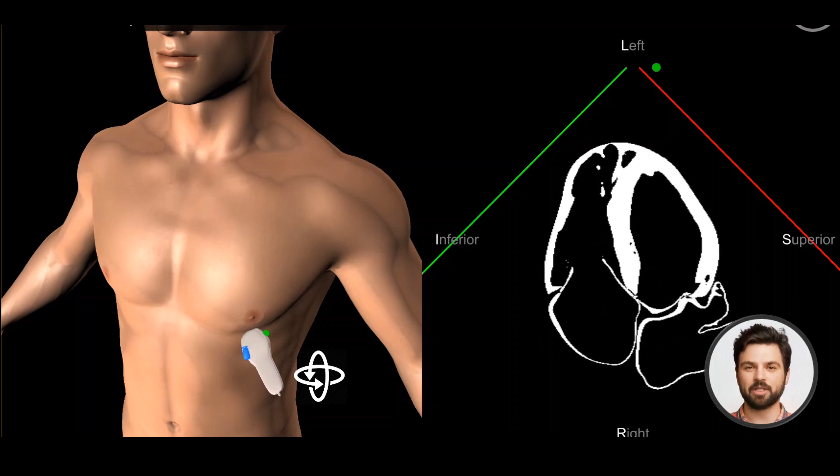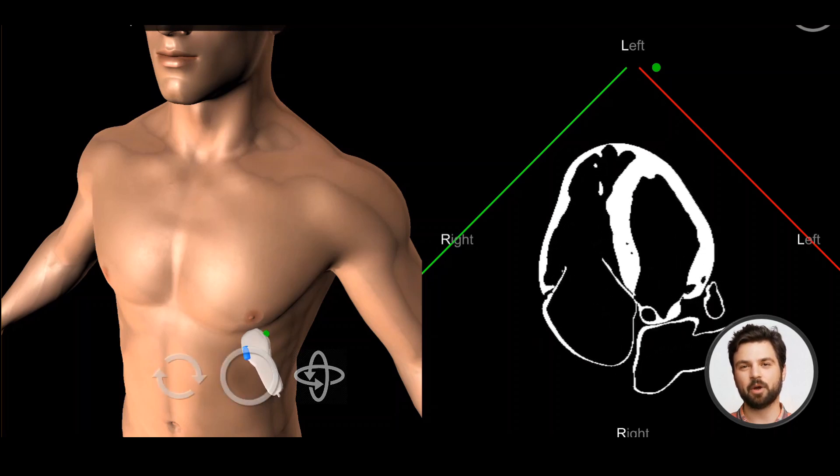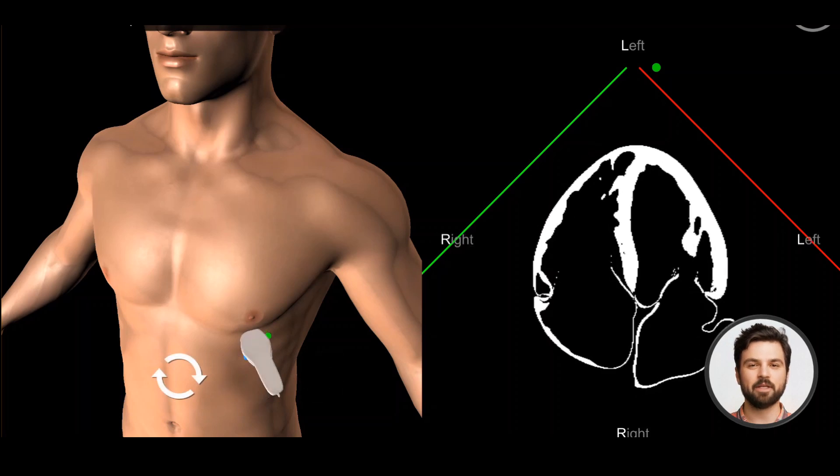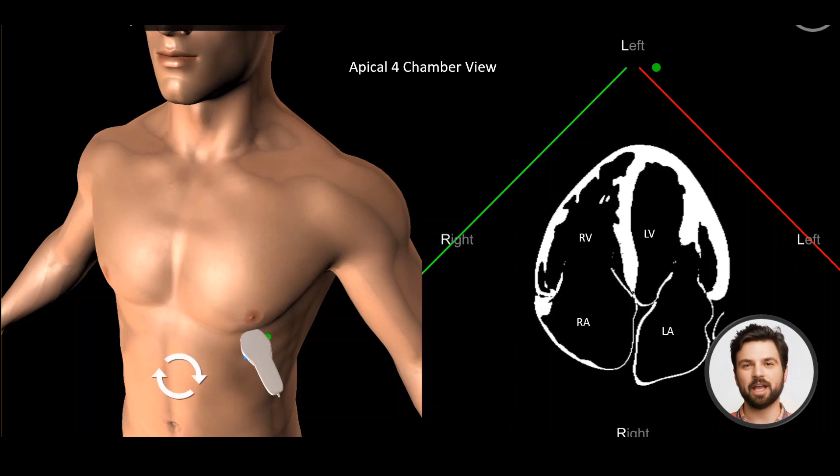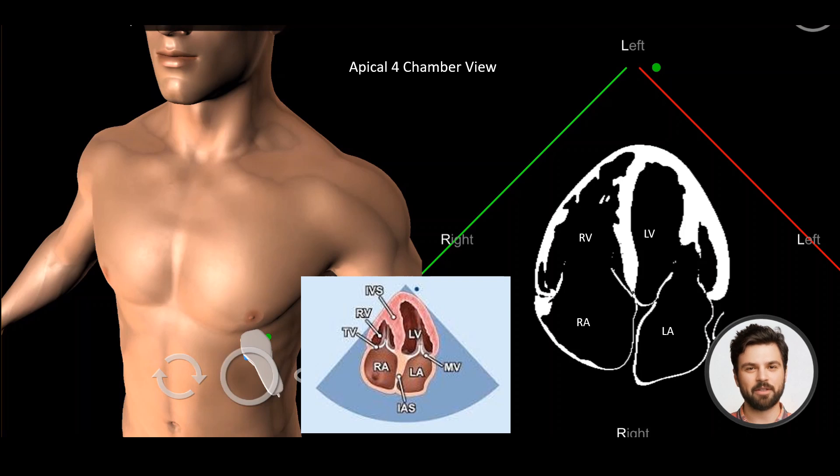The probe should be angled cephalad with the probe orientation marker facing the patient's left flank. The ultrasound beam should cut through the apex of the heart, the ventricles and atria.